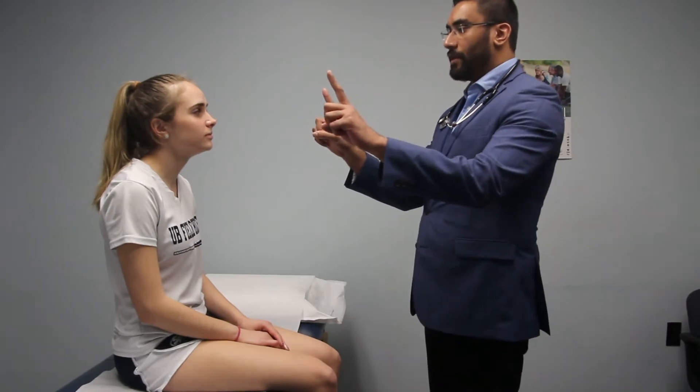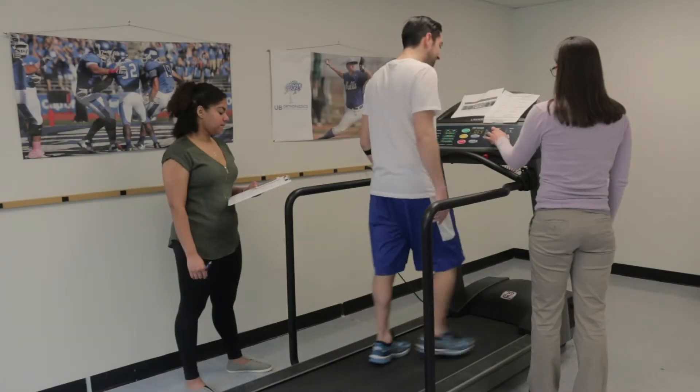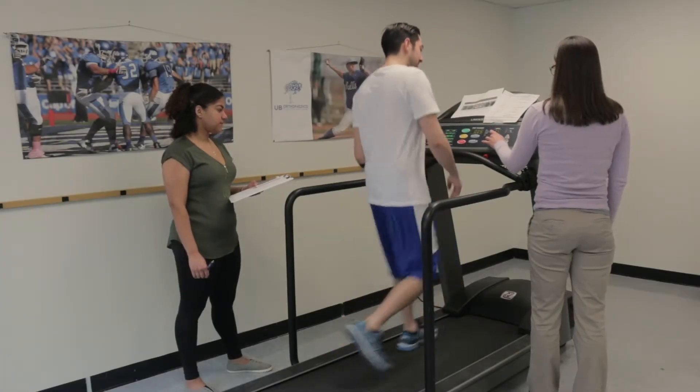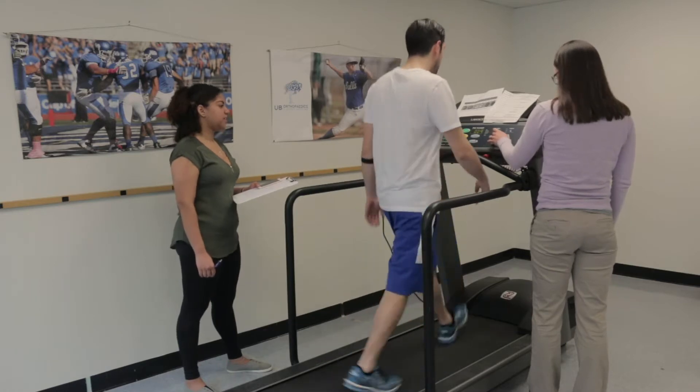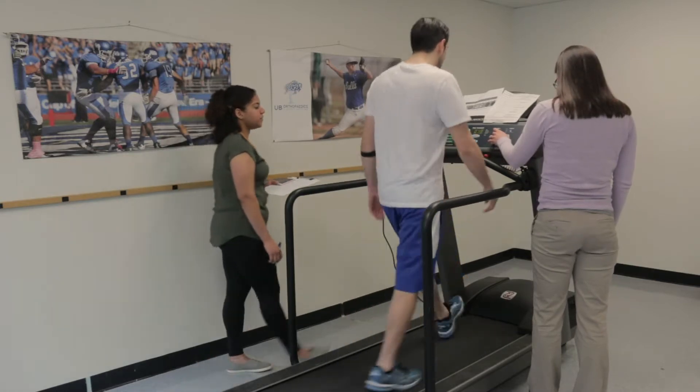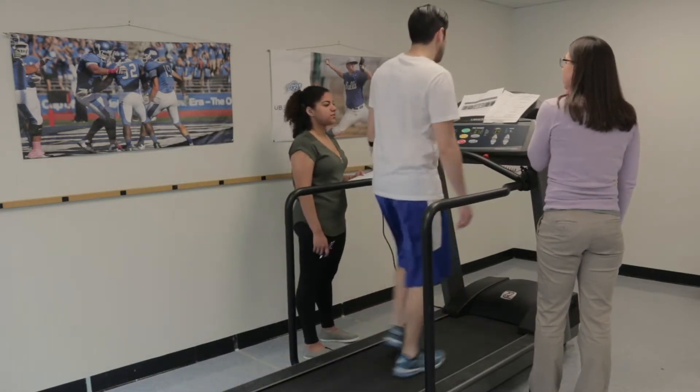Before the patient is tested on the treadmill, they will have been seen by a doctor, both to assess their concussion and assess whether they are able to do the treadmill test. The Buffalo Concussion Treadmill Test was based on the Balke protocol. We've evaluated this treadmill test for safety and reliability, and we've published papers on that.